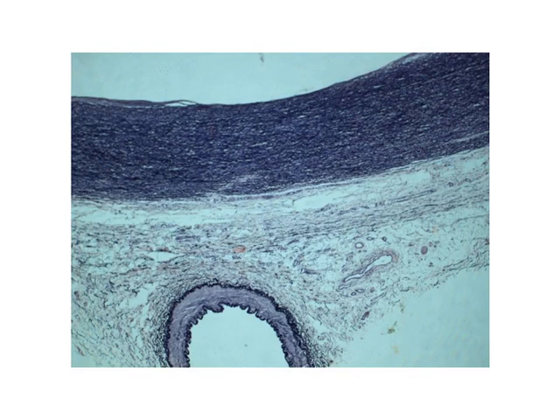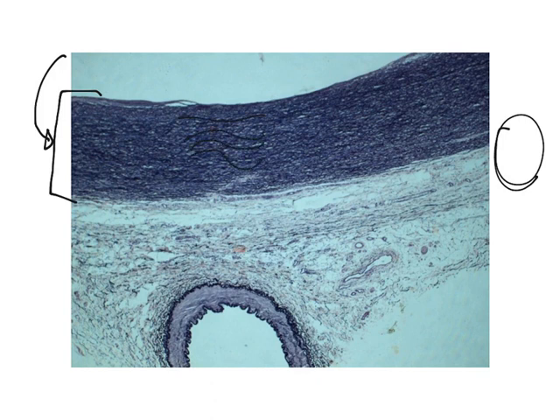Now here is a slide of the aorta. The aorta is very large, and this is even a 4X, and you can't see the whole thing. So it is a very large vessel. What you're seeing on here is something that will let you say, oh, this has to be aorta, because you see all this. If you zoom in, you're going to see a lot of elastin fibers because the aorta is an elastic artery.